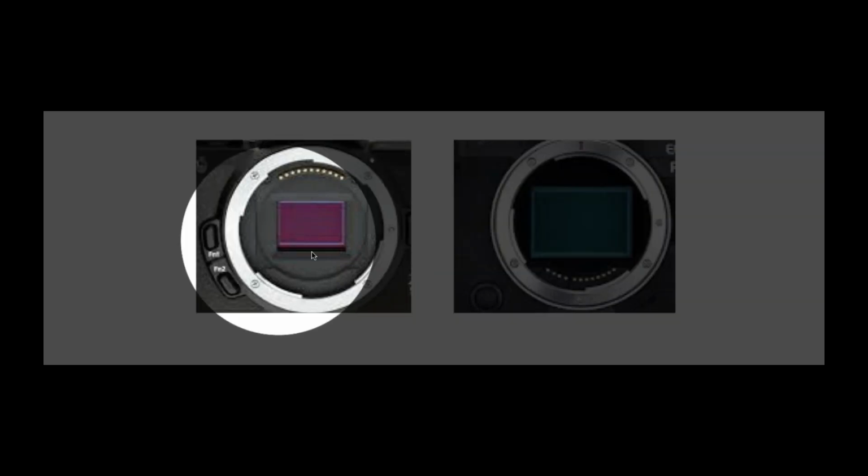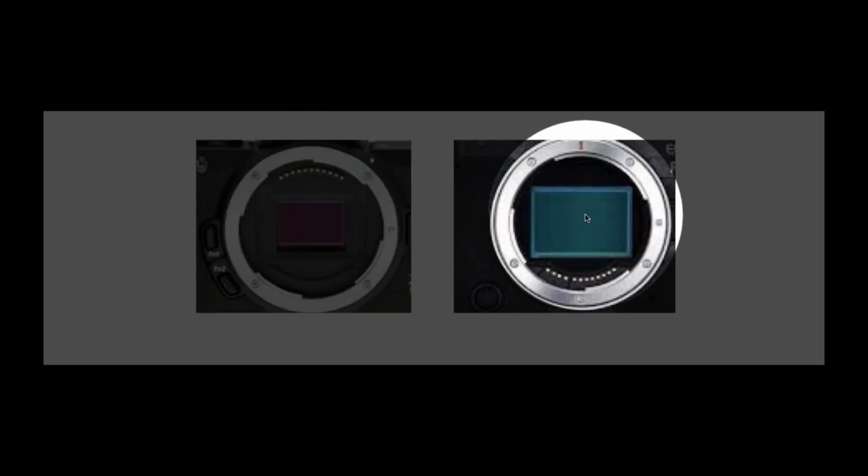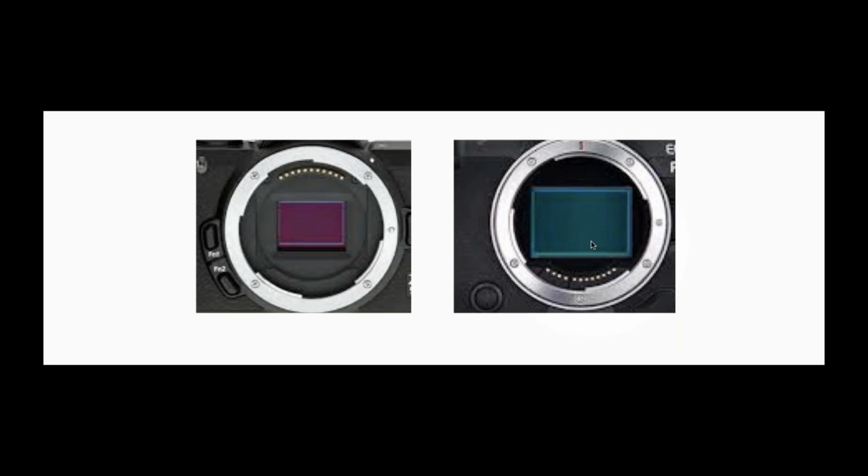So if you notice what happens when I have a half size, you'll notice that it's a much smaller area for me to put all my photographic information on as compared to a full, and the full actually gives me more information to put it on. Now, if this question came to me 4 years ago, I would say you're fine with half bodies, you're fine with the smaller and the cheaper body. They really work great. Today, not so much.